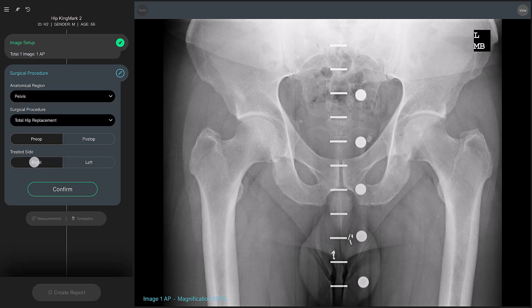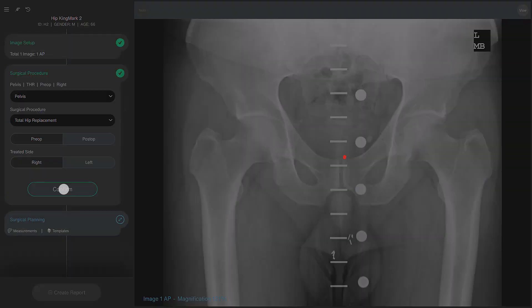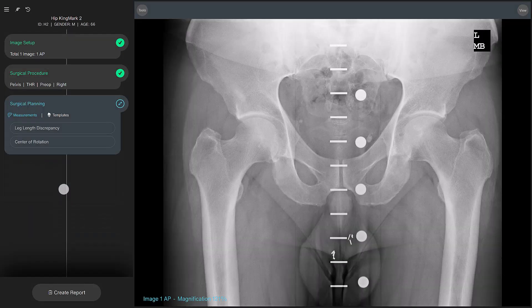Select Confirm to move on to the next surgical planning step, which will involve measurements and templating as indicated by the surgical planning card.